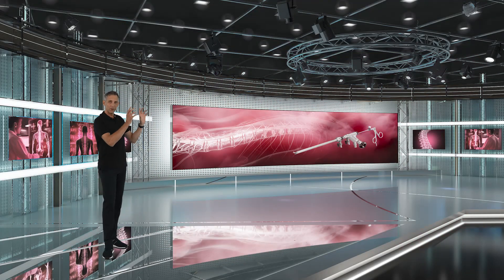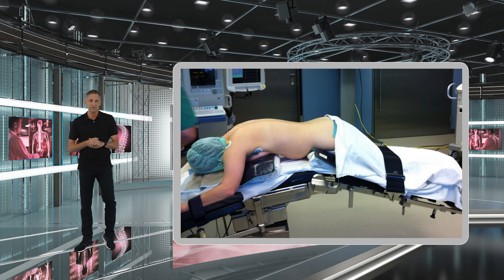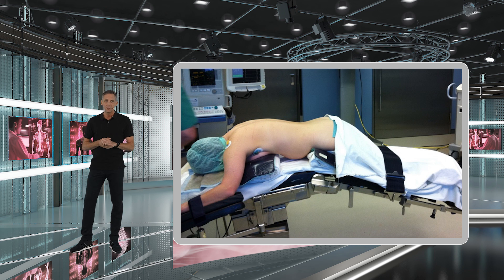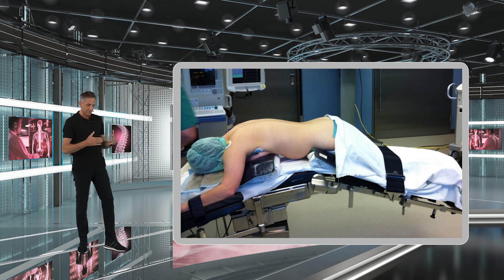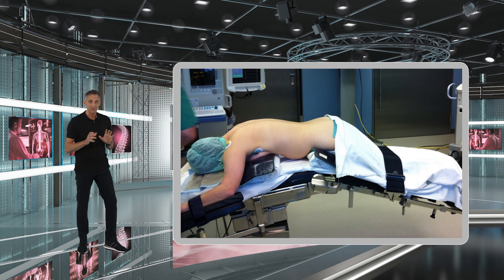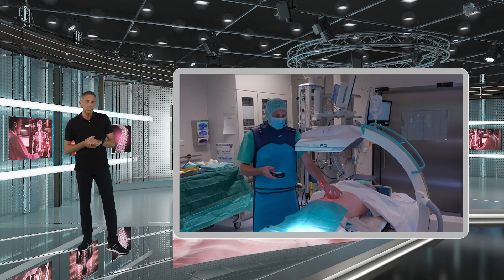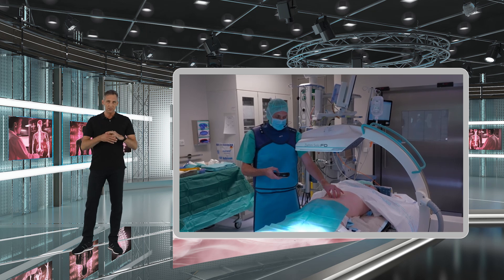You can see here our operating room. The patient is positioned in a prone position on the operating table. What I would recommend is that you put the patient a little bit more to your side of the operating table, so that you don't have to lean over too much during the surgery. This will make it a lot more comfortable for you whilst you're doing the surgery.